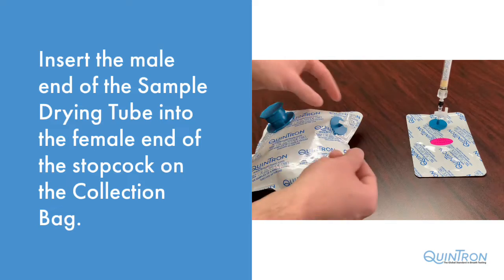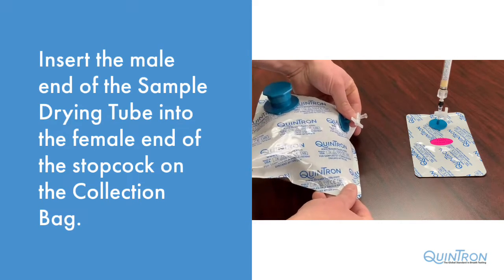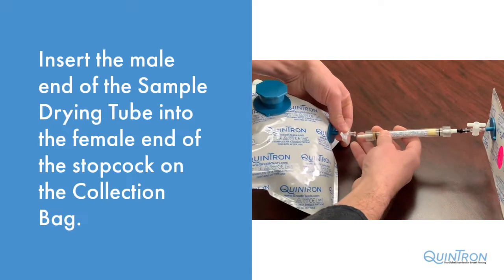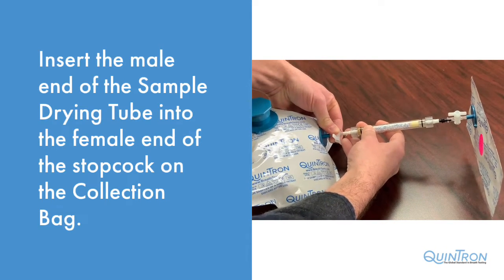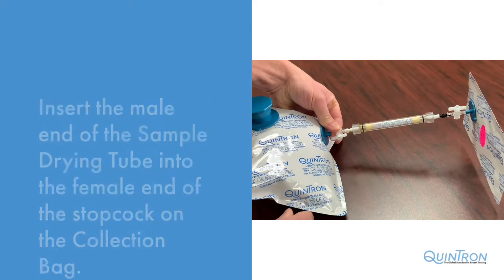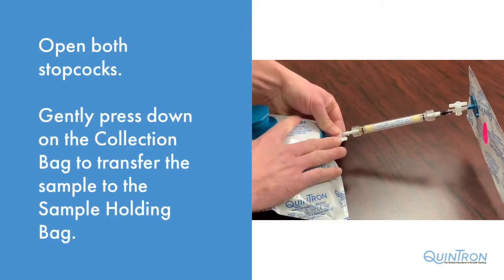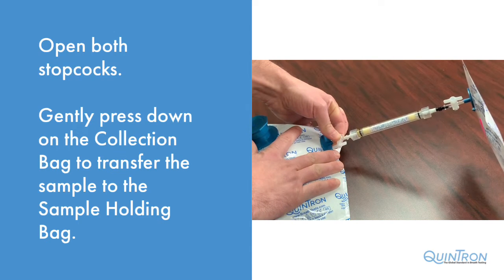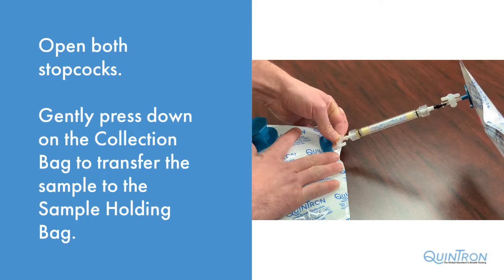Now you will connect the sample holding bag to the gas sampler collection bag. Insert the male end of the sample drying tube into the female end of the stopcock located on the collection bag. Open the stopcock. While holding the stopcock on the collection bag, gently press down on the collection bag to transfer your sample from one bag to the other.